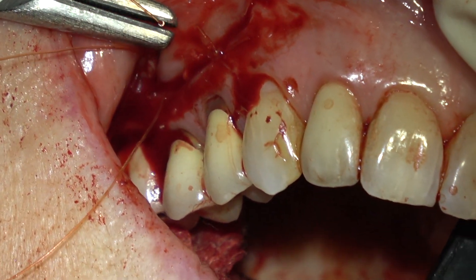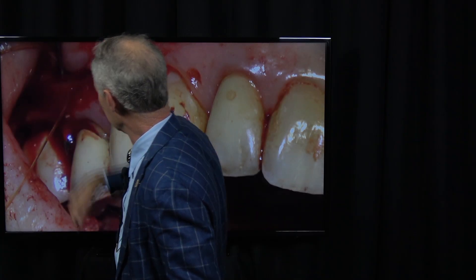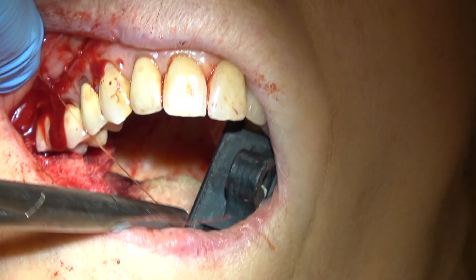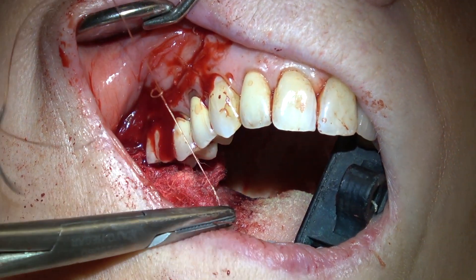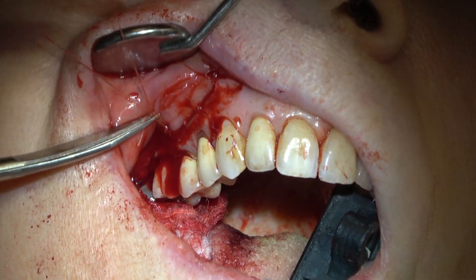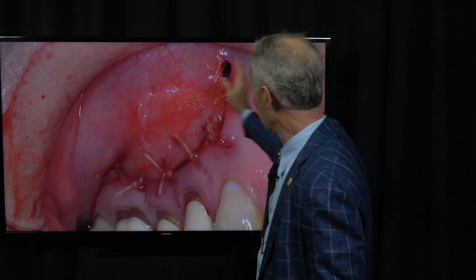Then I'm going to suture that with 4-0 Gut Suture. When you're suturing, it's important that you reflect this coronal tissue just a little bit so you can get your needle into the tissue — if that tissue is adhered to the bone, you can't get the needle in. You want to take a pretty big bite so it doesn't pull through the tissue. I'm going to put four or five of these 4-0 Gut Sutures in that incision. There are a couple of little holes here, but that won't matter because when I'm not reflecting the lip, this will close together.